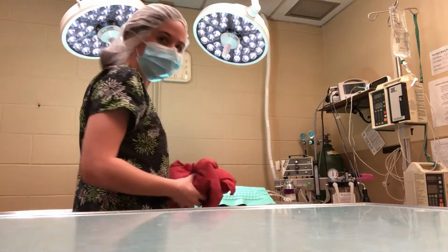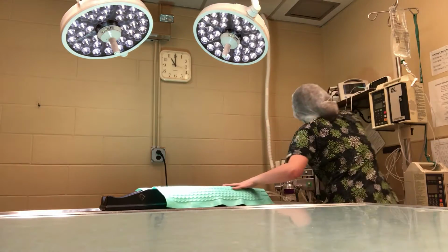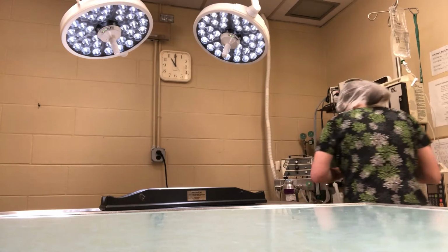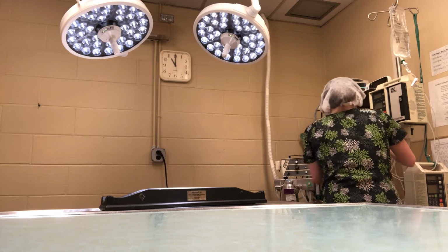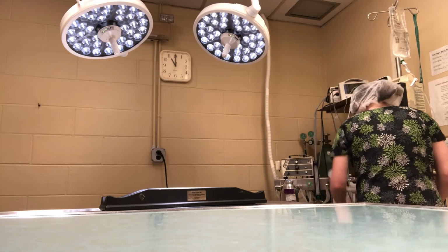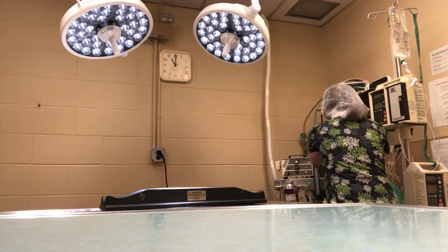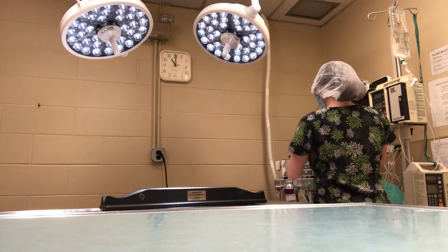And this will be going in the laundry to get washed. And I'm going to turn off all the machines, make sure nothing is on. I'm going to hang everything up in their proper places. And I want to make sure that nothing is tangled, so I'm just going to untangle all of these wires.